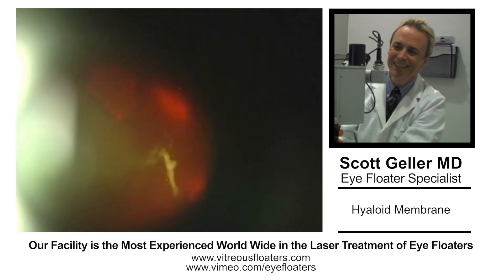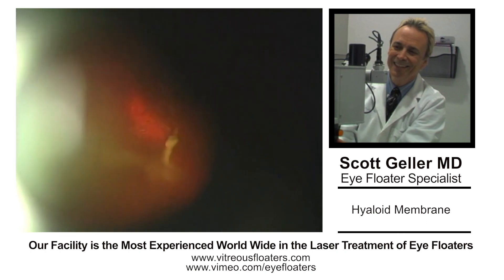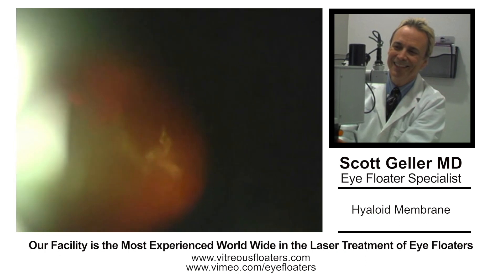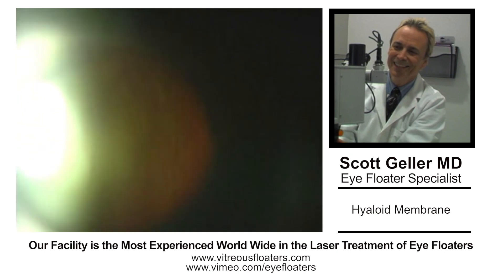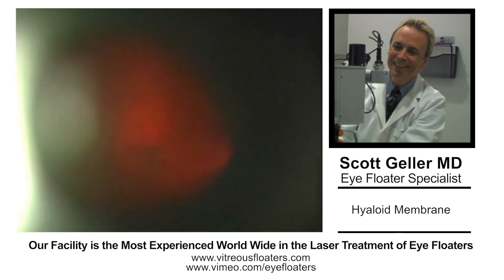In this case, we're speeding it up a little bit for the video. The Lezog laser has a burst mode of 5 to 9 — we're using a 5-shot burst here with a power of about 5 millijoules per burst. You can see we're gradually cutting away the thickened hyaloid membrane from the Weiss ring type opacity, creating a window. This is more difficult than most ophthalmologists would think. It does take up to 4 sessions minimally — the average case takes 2 to 4 sessions.